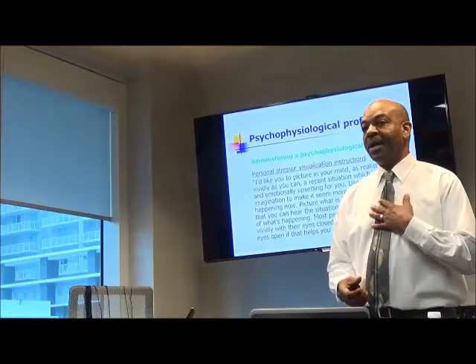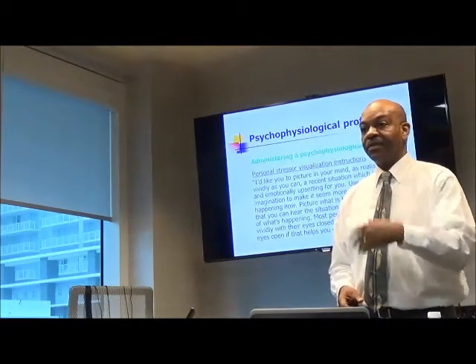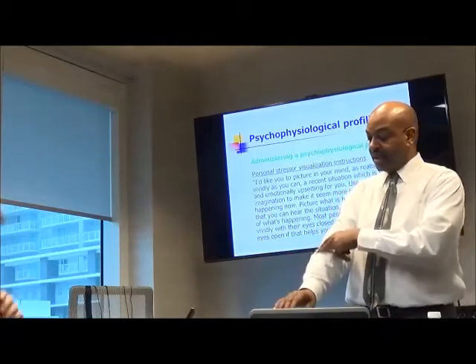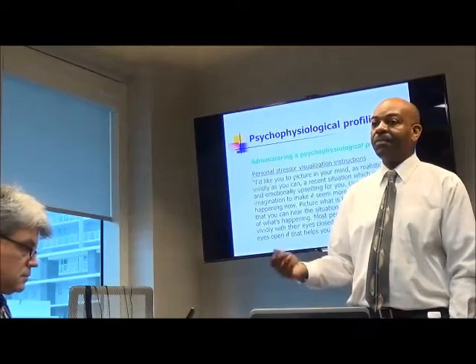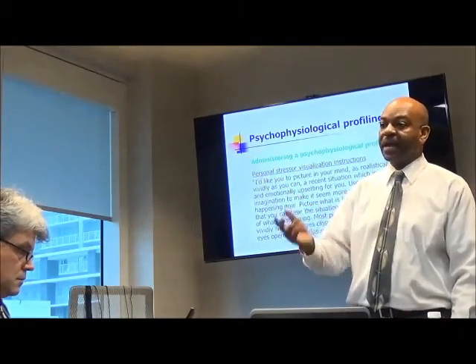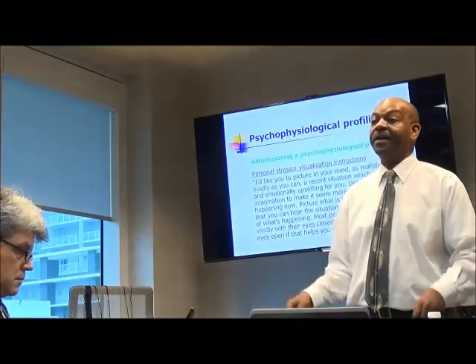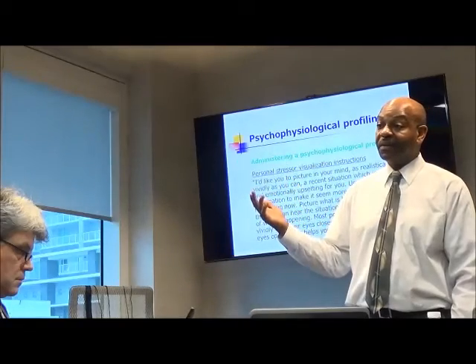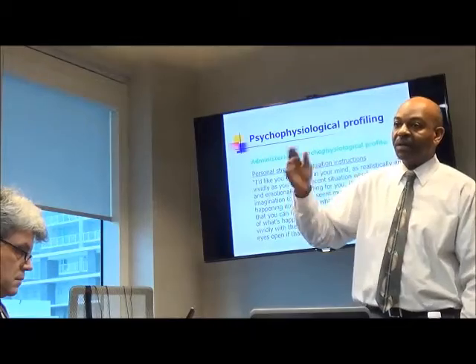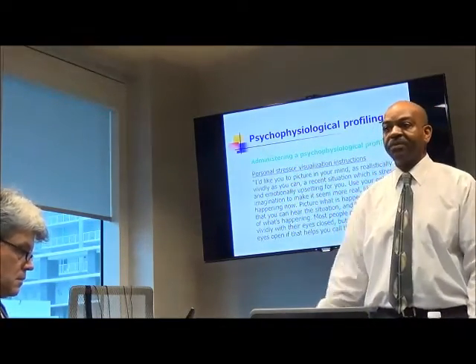But what I do is I just take that into consideration and I'm watching the person as they're talking. So if I see them talking like this and I had the sensors on their arm, I'm realizing that I'm going to see an increase in their readings that had to do with them using their hand. But now when they stop talking about it, if the reading is still elevated, that's still meaningful. Even though the elevation while they were talking is not as meaningful, the lack of recovery is still meaningful.